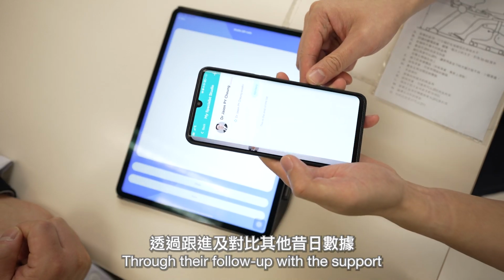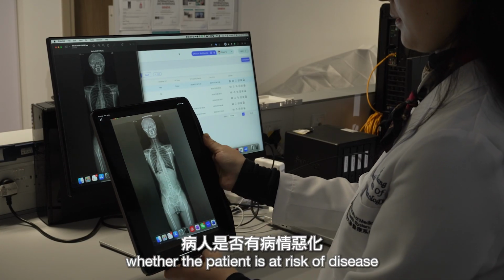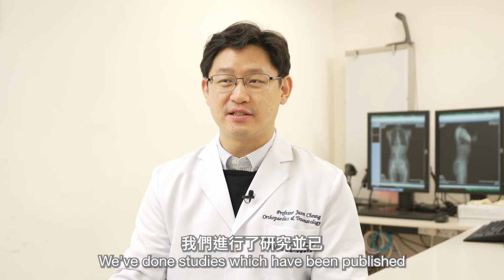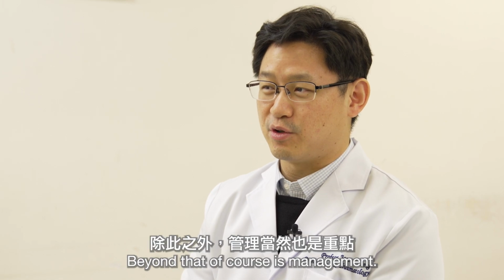Through the follow-up, with the support of our previous data set, we can actually predict whether the patient is at risk of a disease progression or growth spurt. We've done studies which have been published showing that the accuracy is pretty much on par with a professional. Beyond that, of course, is management.